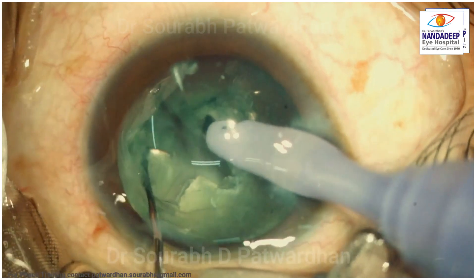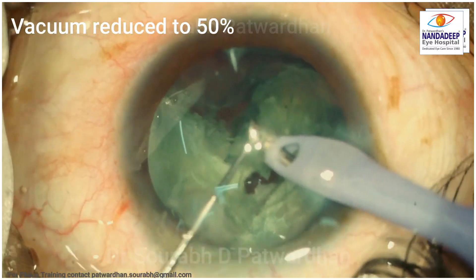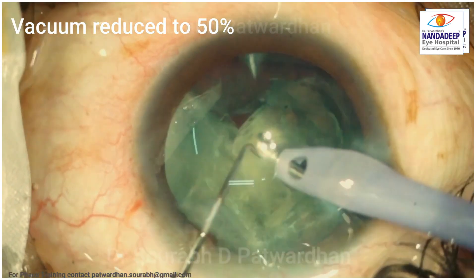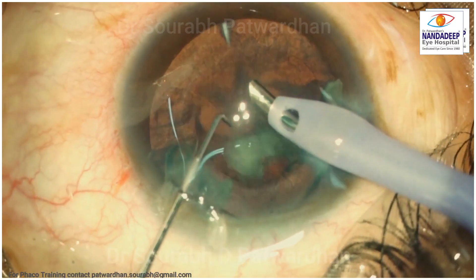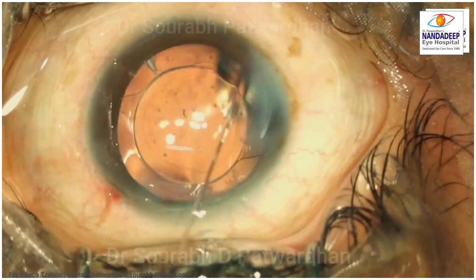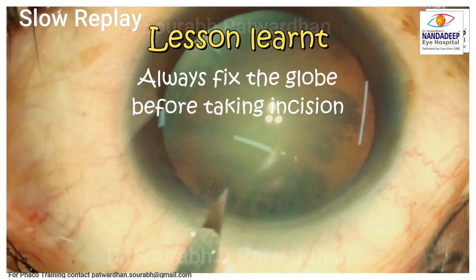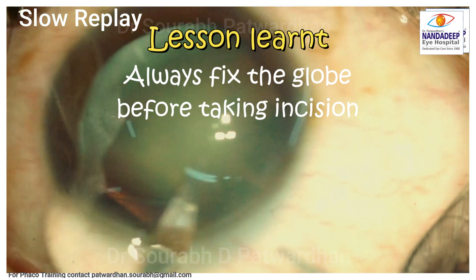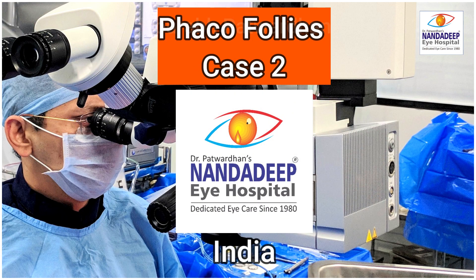One option is to suture this and make another incision and complete the surgery. I could finish the surgery by lowering the fluidics, reducing the vacuum to 50% and flow rate to 50%, and complete the surgery without any other complication. But I learned from this that we must stabilize the globe before taking incision, otherwise inadvertently we may make a very large incision which may have deleterious effects.